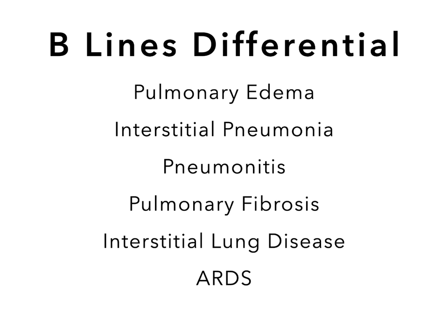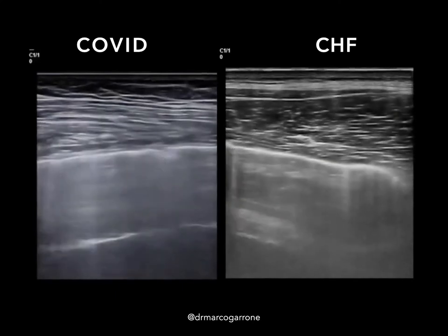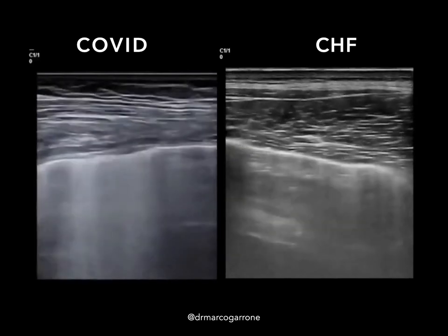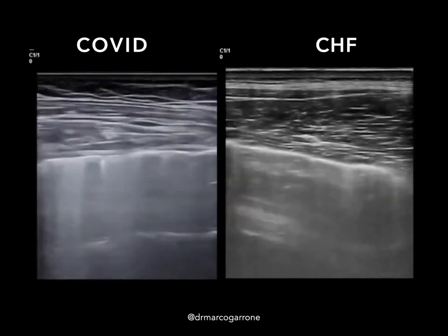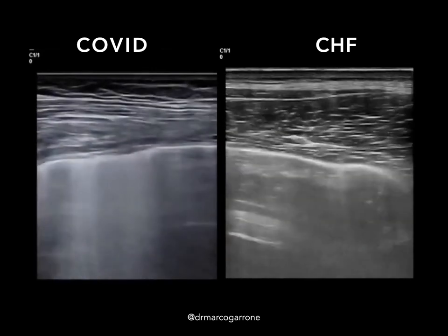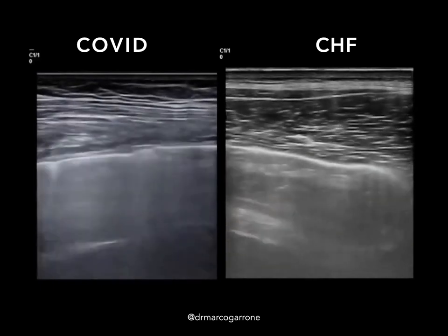Remember that B lines are an artifact representing thickening of the interlobular septa, so B lines have a differential that includes pulmonary edema, pneumonitis, pulmonary fibrosis, interstitial lung disease, and ARDS. One clue to help distinguish COVID versus pulmonary edema is to look carefully at the pleural line. This example from Italian physician Marco Garone shows the clip on the left with an irregular pleural line in a patient with COVID, while the clip on the right has a nice smooth pleural line in a patient with CHF.